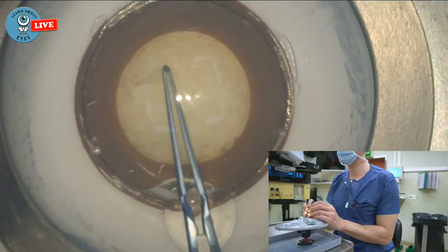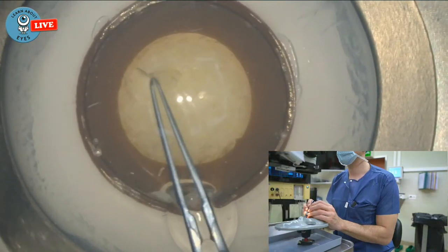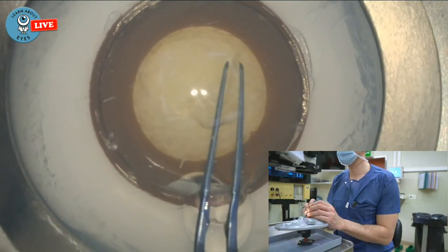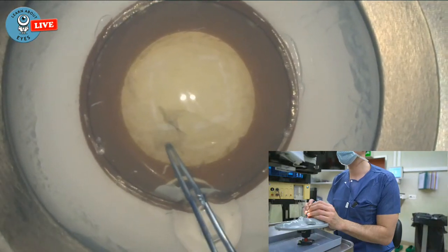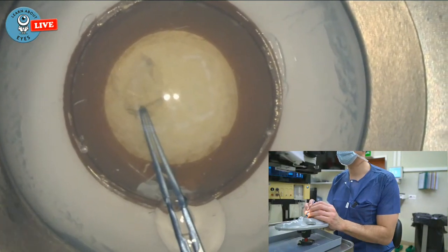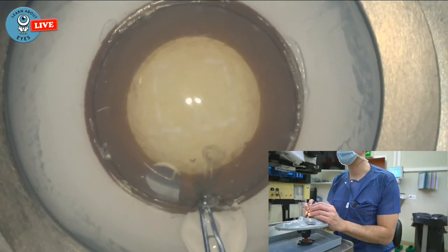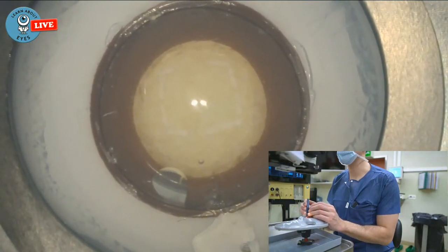So it doesn't want to rip this way. I just did it the other way. Try to keep it from going out. Now this capsule is pretty hard to see. I think they would want you to stain it, but I don't have trypan blue here, so I can't. So a nice big rhexis always helps. Let's get this out. And these are quite hard to get out. Now of course these incisions are pretty sticky because they're silicone. Get most of it out at least.